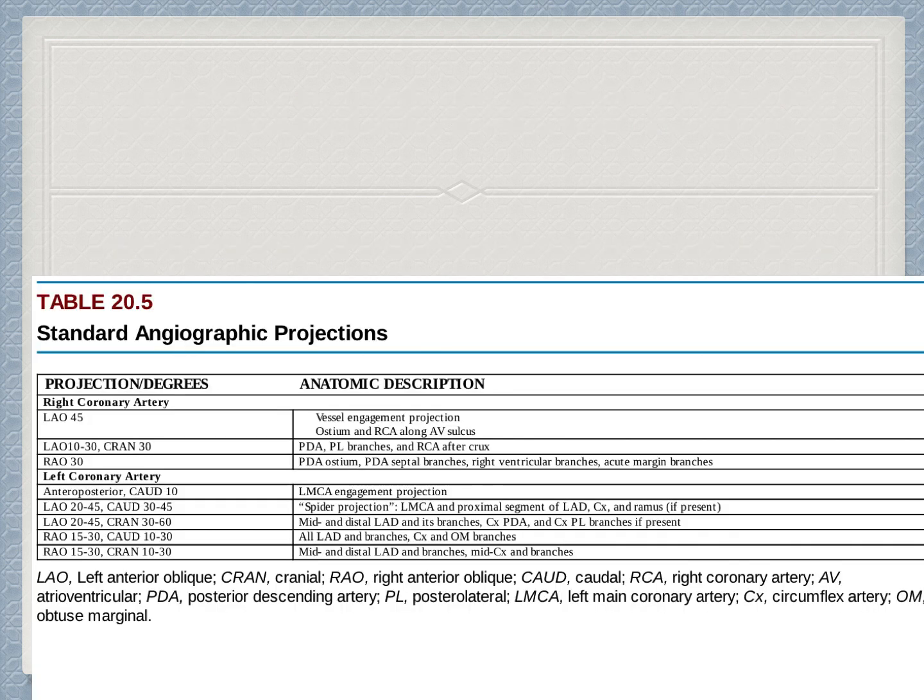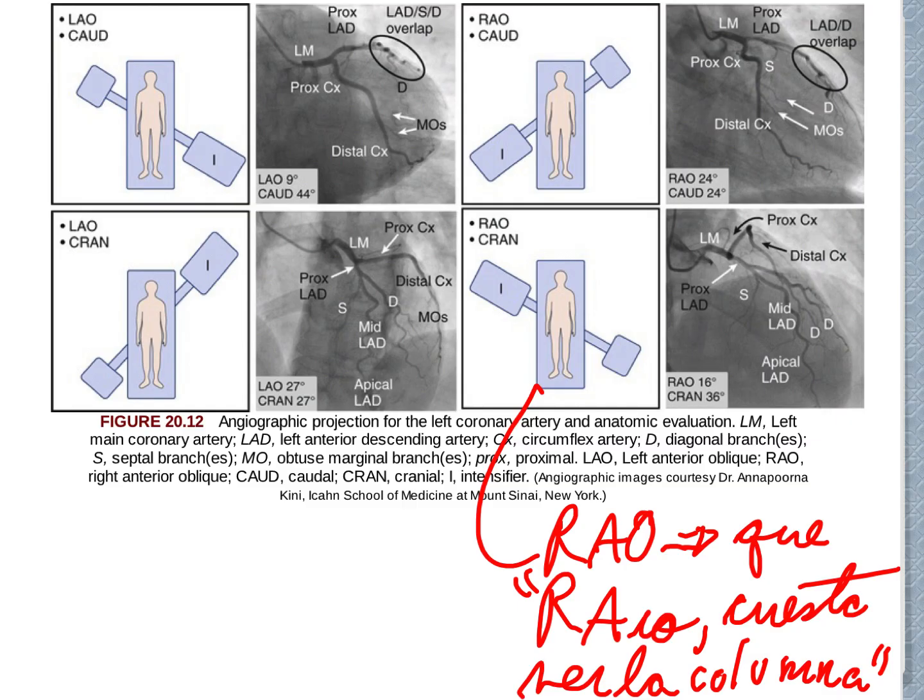These are the standard angiographic projections. Here we can see what each of the different projections we've talked about in the previous summaries looks like in the angiography lab. You can pause the video and watch this through. This is pretty hard. Don't think it's a good idea to memorize it, because if you don't understand it, you will forget it pretty soon. We are more focused on you understanding the main concepts. That's why the last summary was based on understanding the projections and orientations.